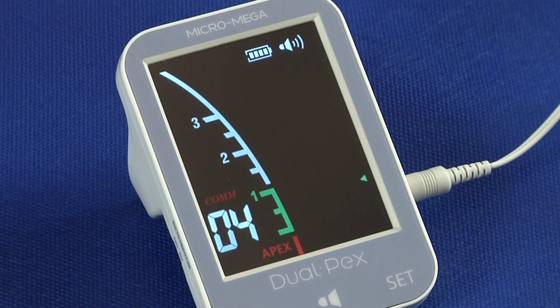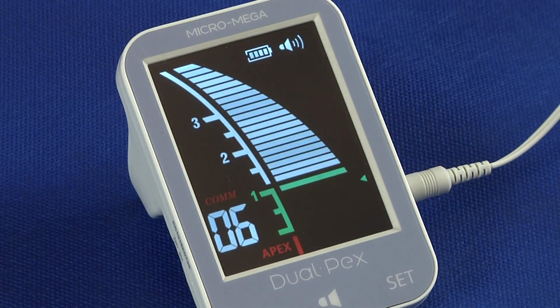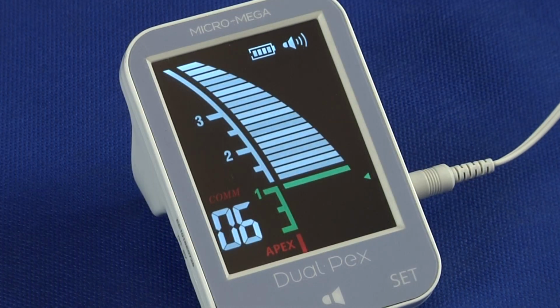The horizontal bars show the movement of the file inside the canal towards the apex. White in the front region of the apical constriction. The color goes green in the apical region and red beyond the apex, with the label Apex blinking. The figure on the left indicates how close the file is to the apical foramen in terms of remaining number of bars before reaching it.